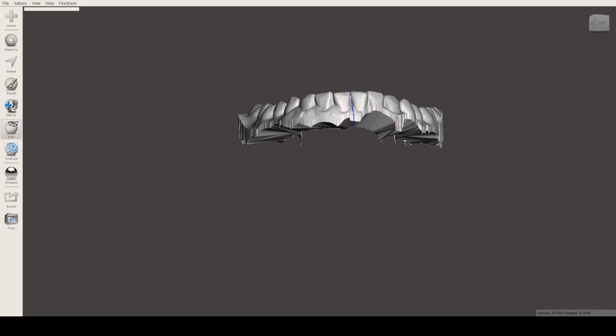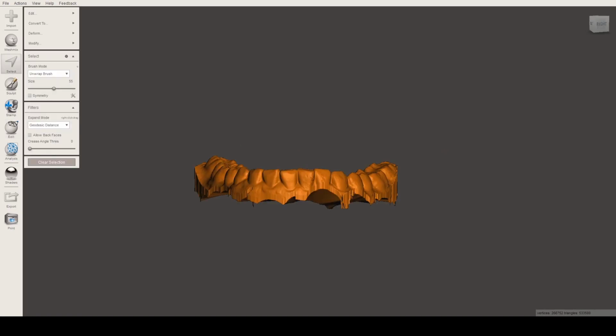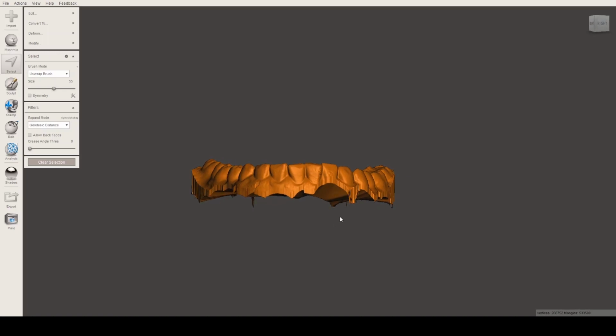Oh, my Meshmixer crashed. So let me just open it. Let me get back to this. I'll cut to that part again. Sadly, I did not recover the file. Meshmixer just crashed. So I hope next time it recovers the file automatically, because it would be a pain if it crashes just like that and I can't recover my files again, just like what happened just now. But it's okay. I transformed it once again, but yeah, we are done with select and separating.